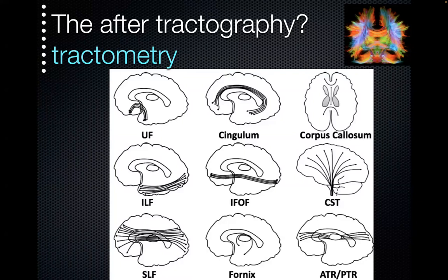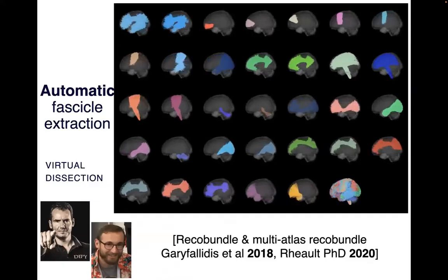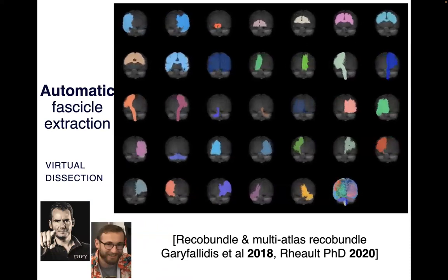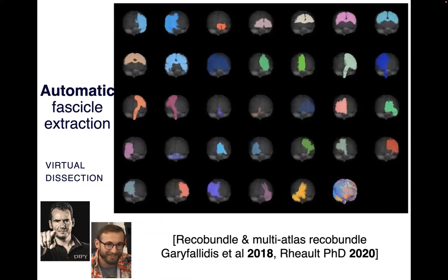Again, it's nice to see that the field is moving forward. There are many methods out there, but all of us as a community are converging on 50 or so tracks that are almost press button. So you run TractoFlow, you run MRtrix, and then you feed that to a segmentation algorithm, a little bit like FreeSurfer, but this will extract tracks, regions of interest. With our tool, included in our pipelines, you have more or less 50 such tracks that are robust to crossing fibers.